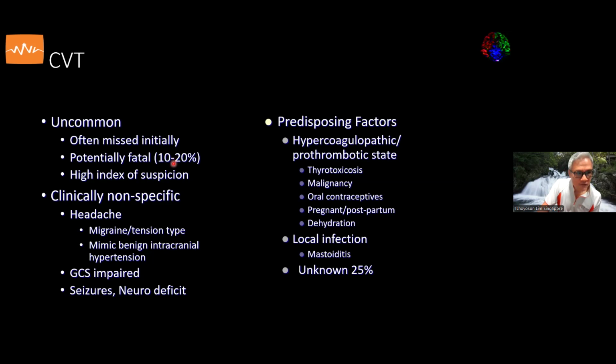diagnosis. Unfortunately, because arterial thrombosis is much more common than venous thrombosis, it is very often missed and misinterpreted initially, and the occlusion isn't always easy for us to detect.